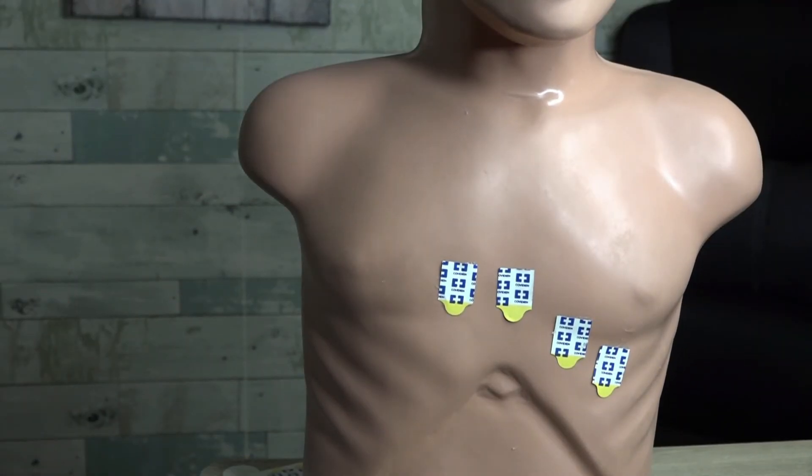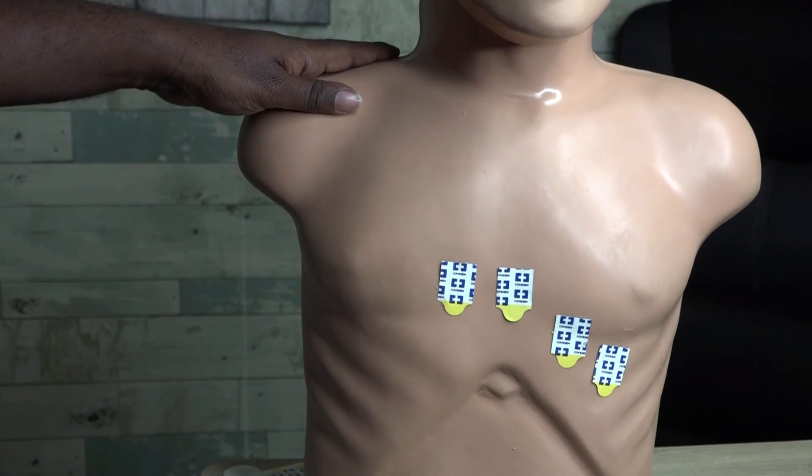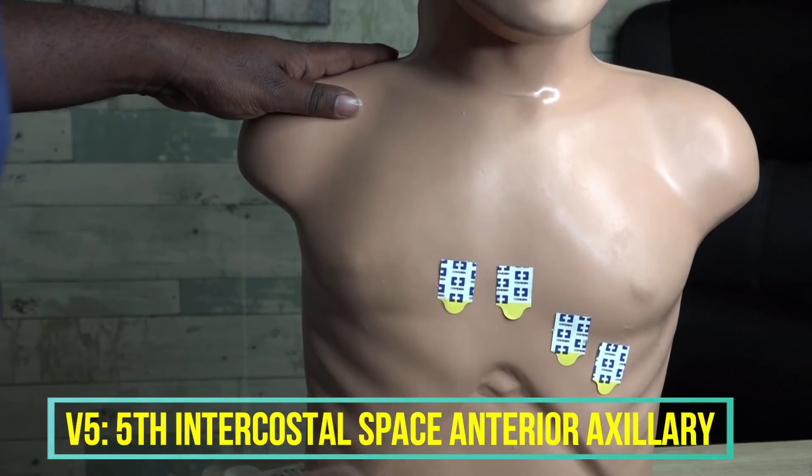Moving on to V5: V5 is going to be at the fifth intercostal space, just like before, but instead of being at the mid-clavicular line like V4 right under the nipple, V5 is at the fifth intercostal space at the anterior axillary line.